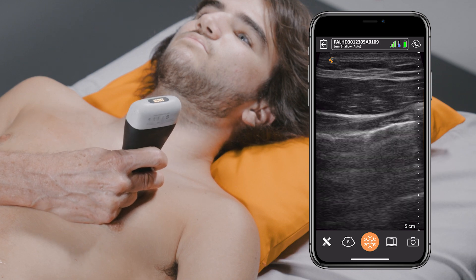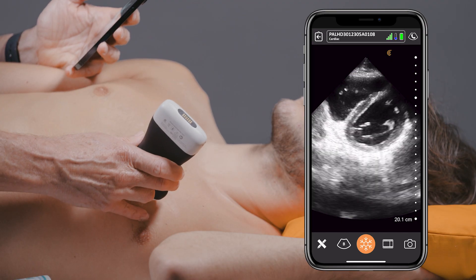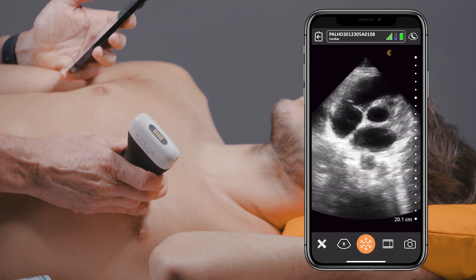Clerius has this brand new transducer called the PAL HD3. It stands for Phased Array Linear, and it actually has two probes put into one. You can probably do 95 to 99% of all the ultrasound scanning you would ever imagine doing with this single device.